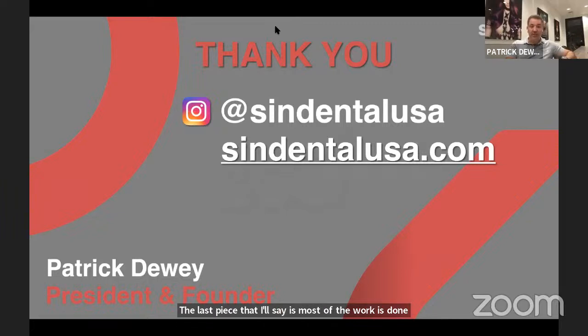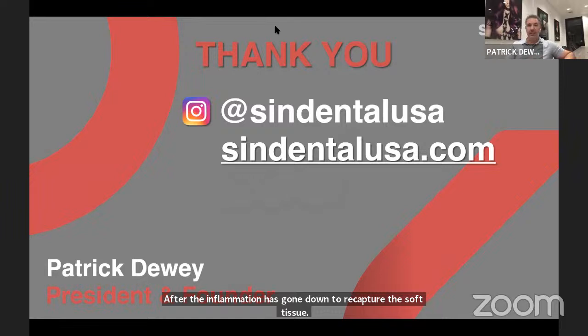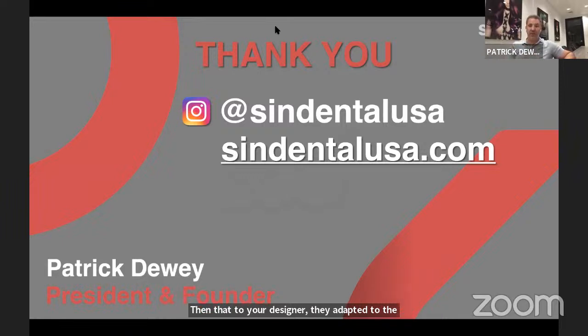So all the restoration hard work, the VDO, the cant, the bite, the midline, all that's already done. So the only thing you need to change here is the soft tissue after the inflammation has gone down. To recapture the soft tissue, send that to your designer. They adapt it to the design. You reprint off another one. If everything looks good, you have that duplicated in zirconia or whatever your desired final restoration would be.